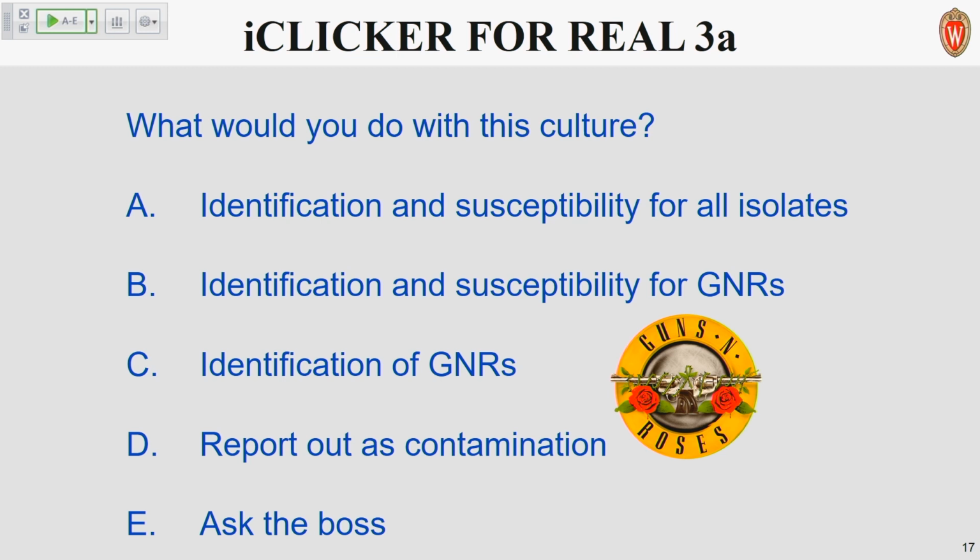Sometimes we get cultures from other labs to read, and they set up with a CNA, and it is helpful for us when determining what the problem is, because we don't get that on midstreams. Sometimes it works in our favor when you can see what the underlying organism is on the CNA, where if it was all GNRs, it would probably cover it up. So it's cost and time and plates, but it really is helpful. Thank you very much.